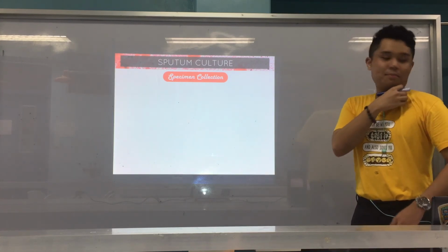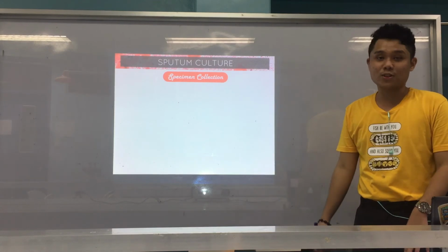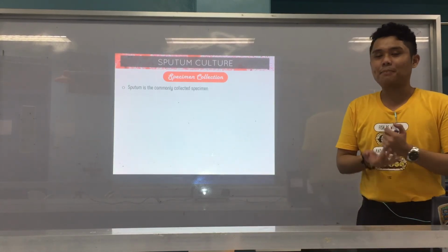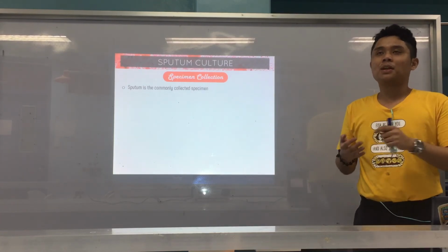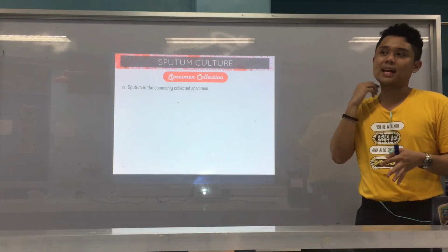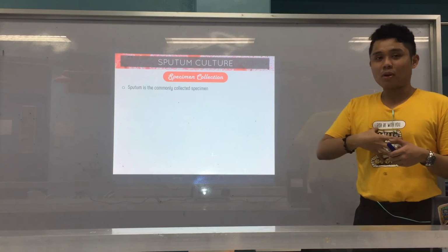Now, before we end this first part of the video, we'll start with specimen collection for sputum. Of course, sputum is the commonly collected specimen. But according to Ma'am Teddy, and as far as I know also, sputum is no longer really referred for culture. Why? Because sputum is saliva, and what you are trying to get is the lower respiratory tract.